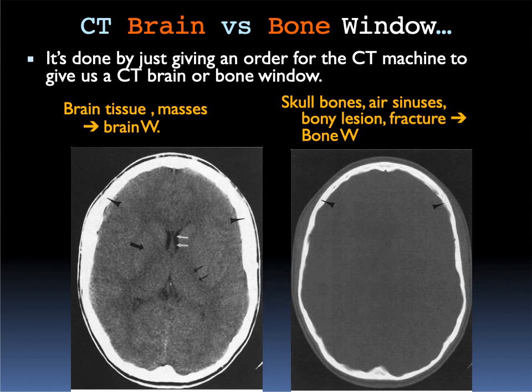And if you go for detection of the bone lesions and fractures, we will make it bone window.